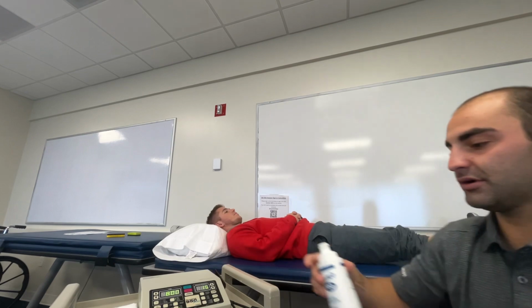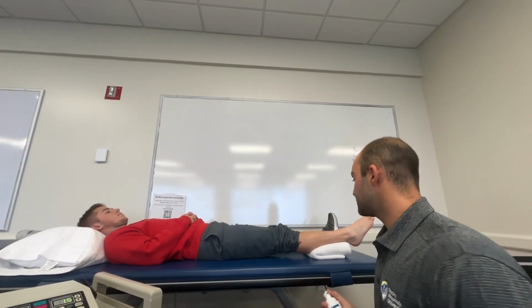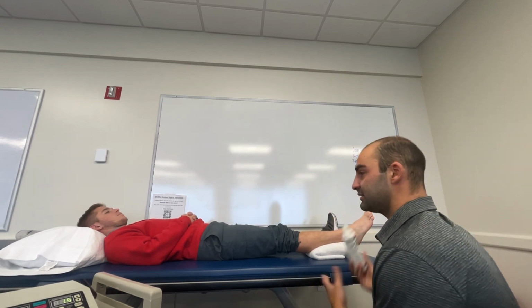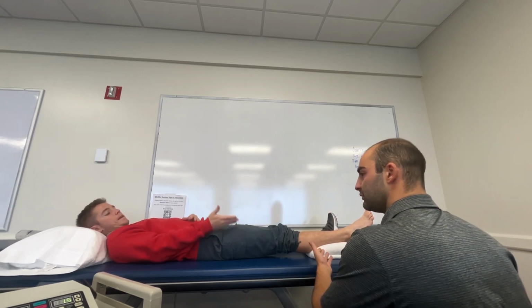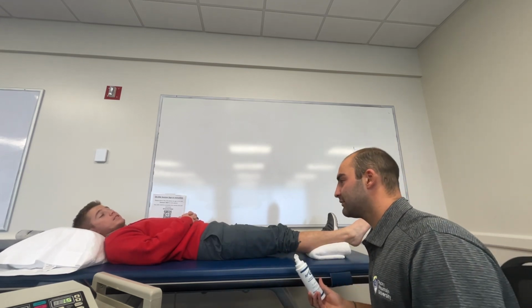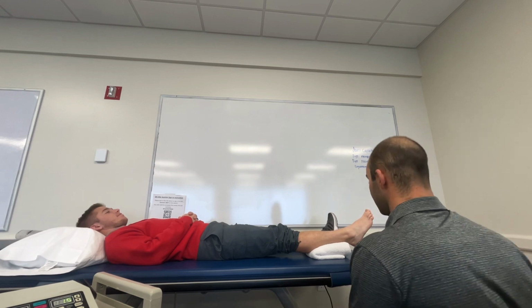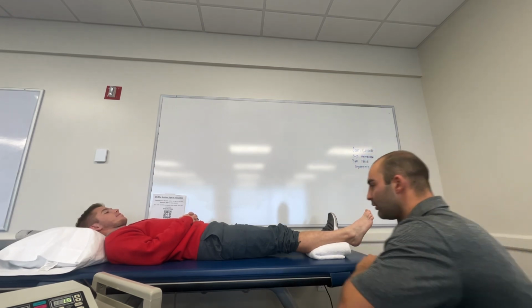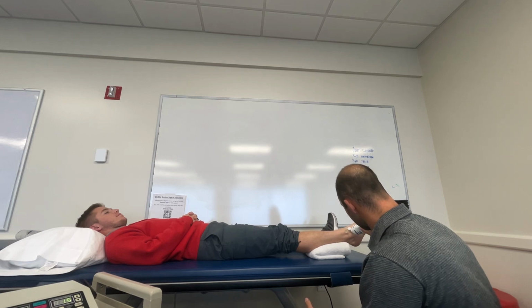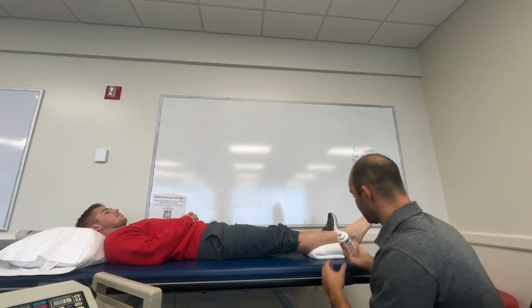And before I start the modality on the ultrasound machine, I do have to apply the conducting agent to the area that we're treating. With that said, is it okay if I apply this gel to our lateral ankle? Yes, please. Okay, and do you understand the purpose of why we're doing this modality? Yes. Okay, perfect. All right. This gel might be a little cold.